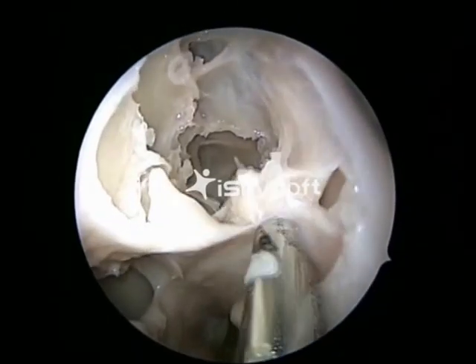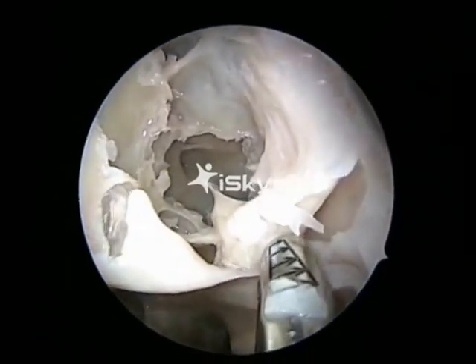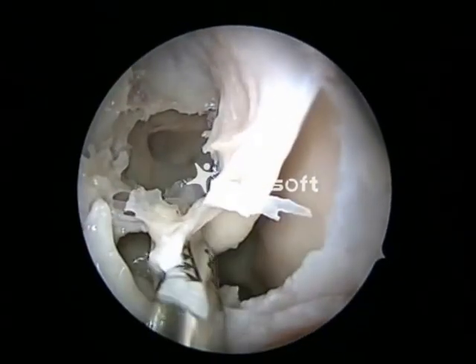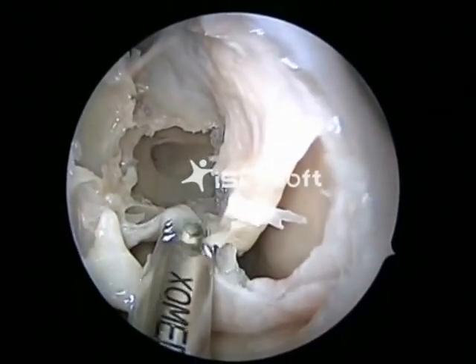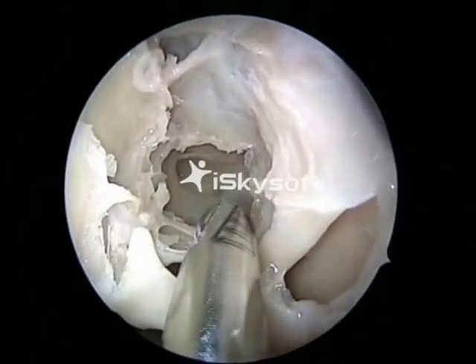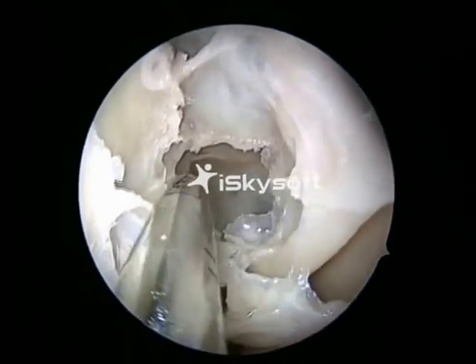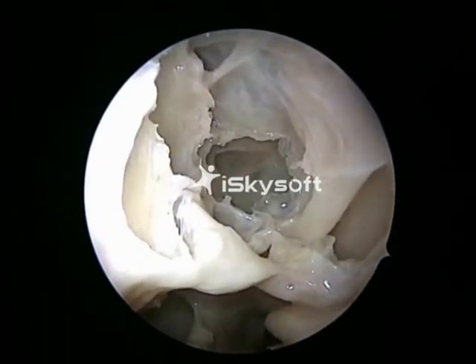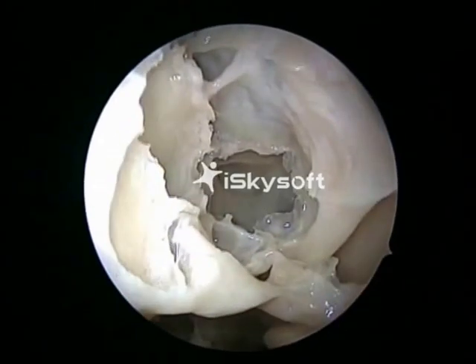Once we debride the posterior aspect of the middle turbinate at its junction with the bulla, we have a glimpse of the superior turbinate. You can now have a very nice view of the superior turbinate, an end-on view of the superior turbinate there. That's the superior turbinate seen very clearly.